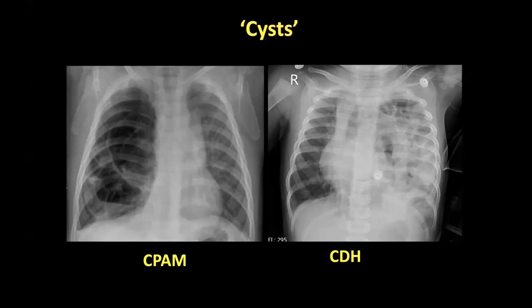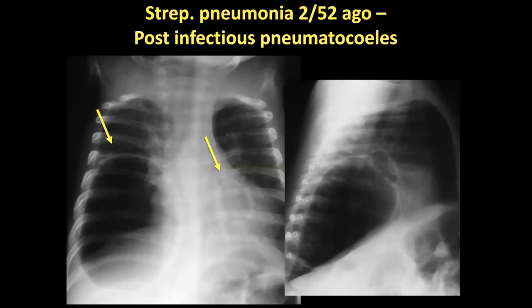Both of these are neonates. On the left there's mediastinal shift and a stomach bubble that looks more like colon — and we couldn't see a colon in the abdomen, confirming a diaphragmatic hernia. Post-infectious pneumatoceles can be very large. We've had vigorous debate about whether they should be managed or left, because they look terrifying. But our cardiothoracic surgeons are quite reticent to get involved unless there's significant mediastinal shift, because generally if the patient is well they do resolve on their own.